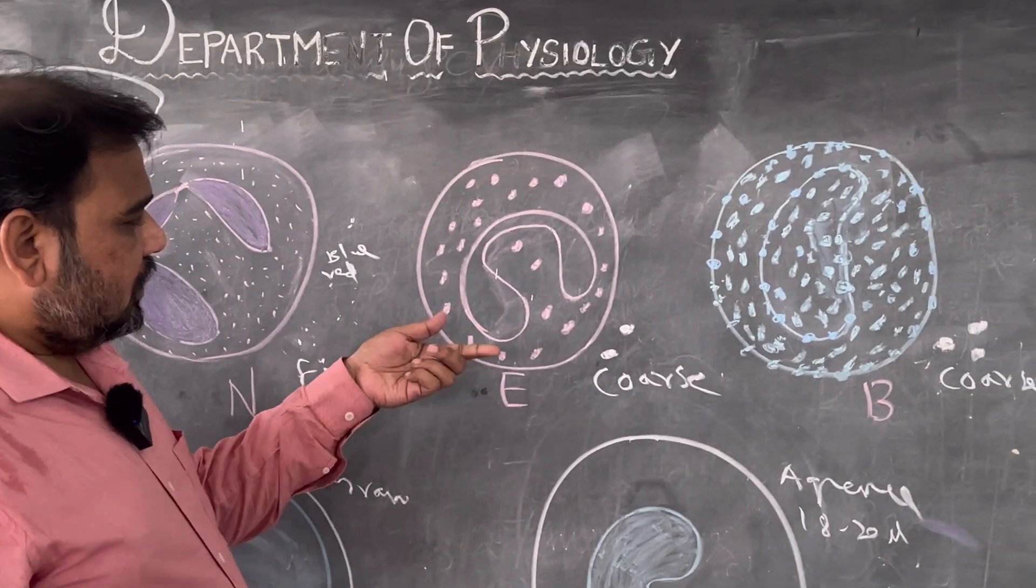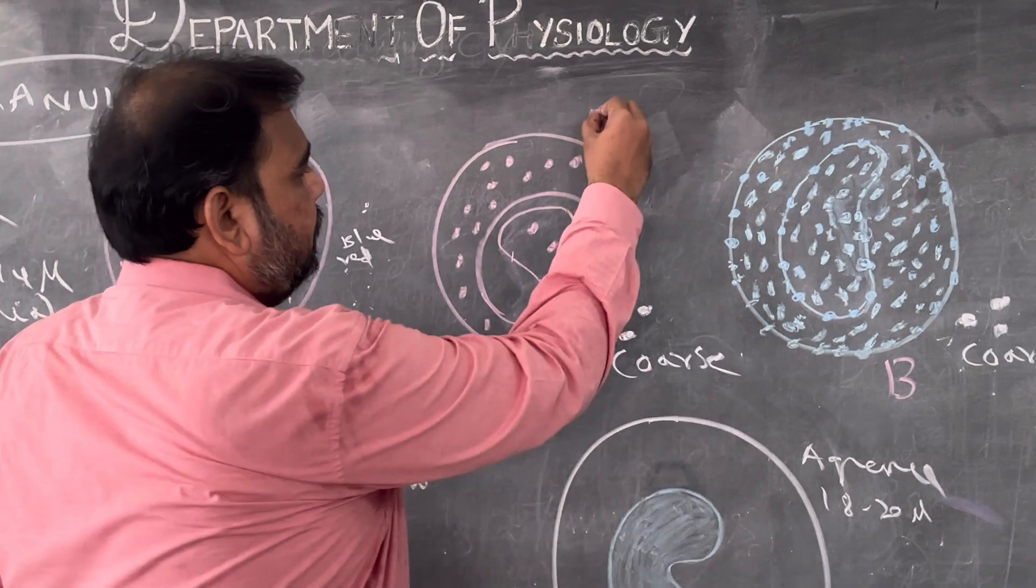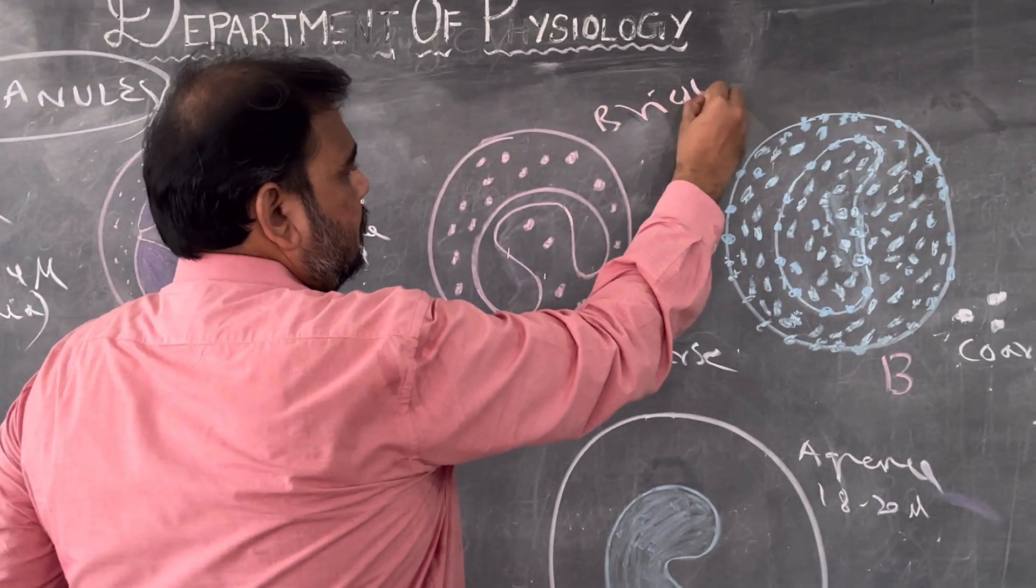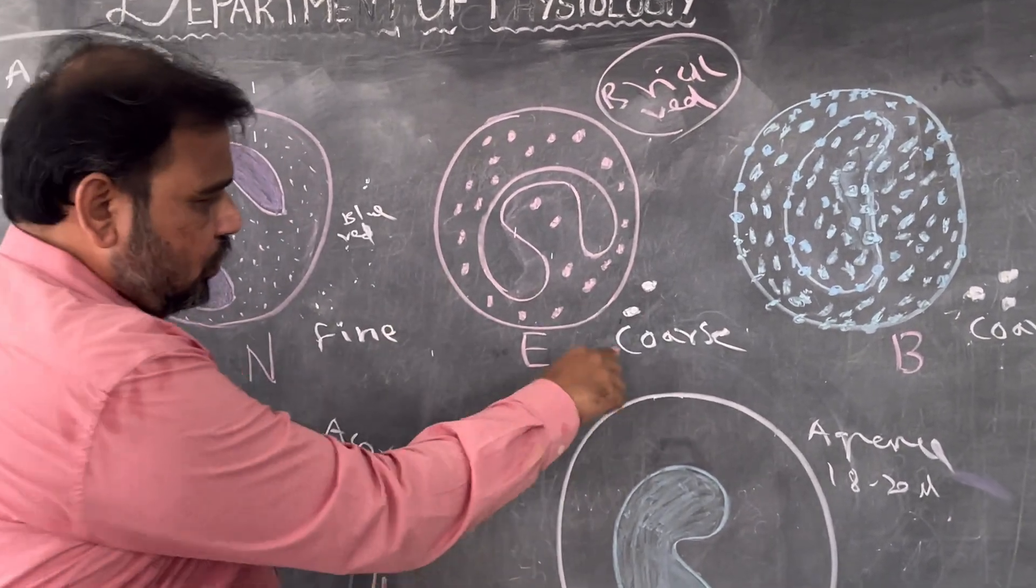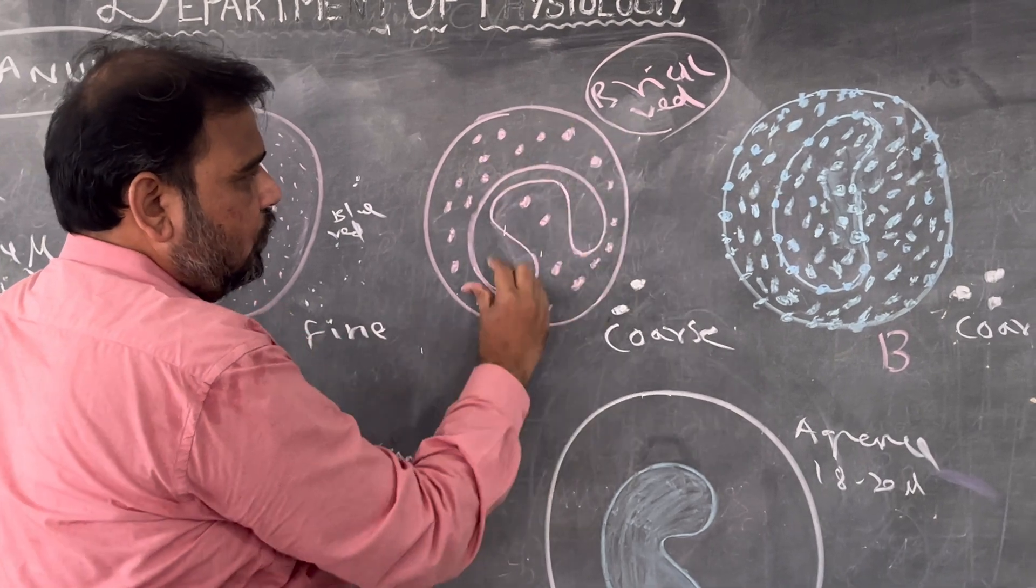Here is eosinophil. See here I used only one color which is brick red. So eosinophil contains coarse, thick, you can see here coarse and brick red.